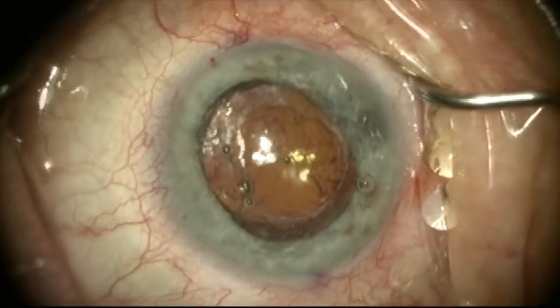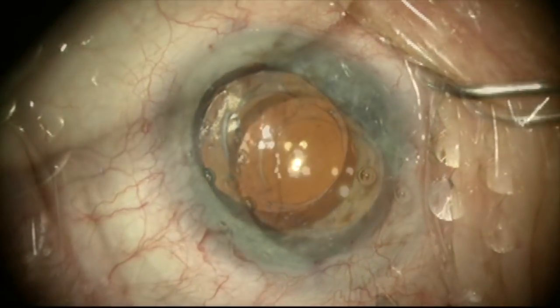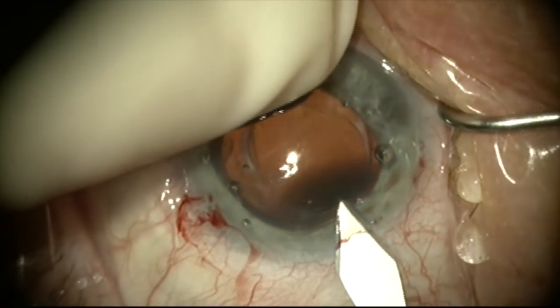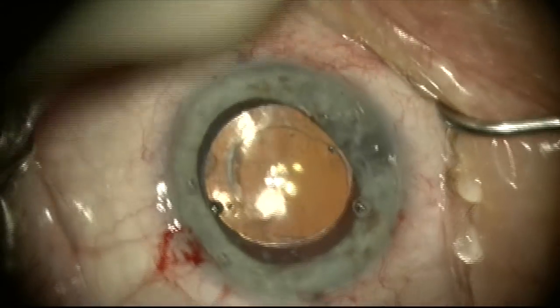Here we're making our incisions and we're injecting viscoelastic using a soft shell technique. We'll now make our main incision with a 2.75 millimeter keratome and we want this to be self-sealing. We'll widen it just a little bit to about 3 millimeters.